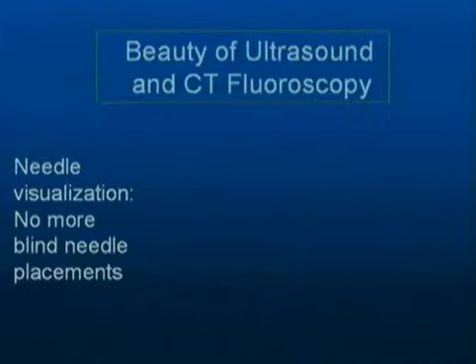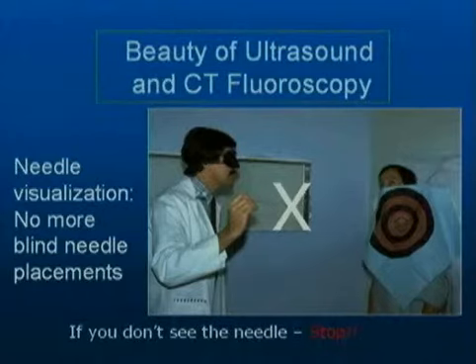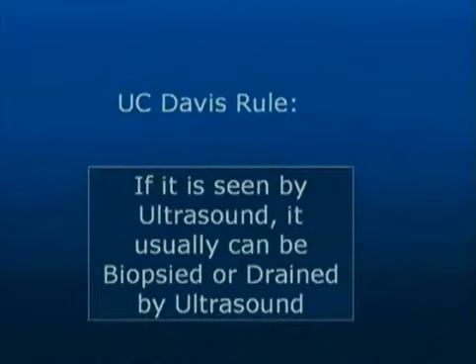Well, the beauty of ultrasound, or now CT fluoroscopy, is we need no more blind needle placements. Well, this is sort of a comic slide. It does have a point. And what I do tell my residents or fellows, if in fact you do not see that needle, you have to stop. I've seen many problems arise where somebody does not see that needle, continues on, and then there is some sort of complication, perforation of a loop of bowel, or perhaps a bleeding complication. So the real beauty of ultrasound that we need to take advantage of is the ability to see the needle.